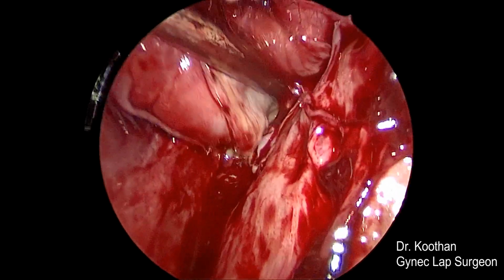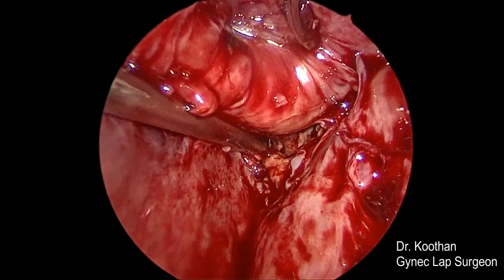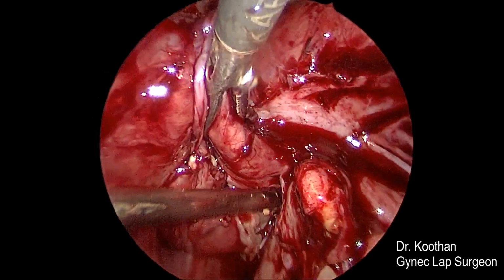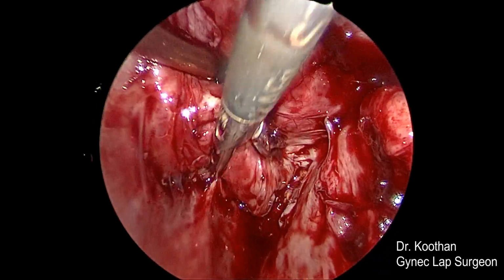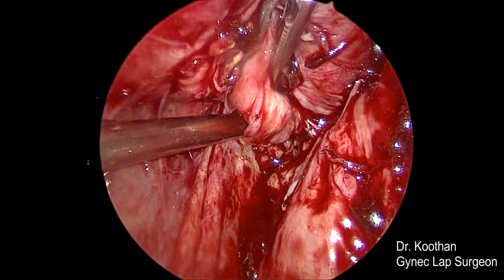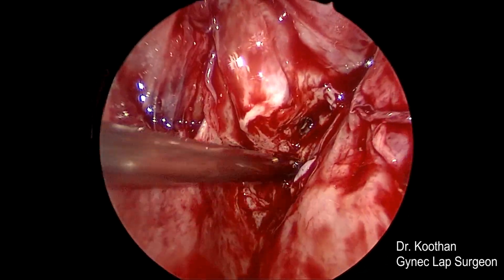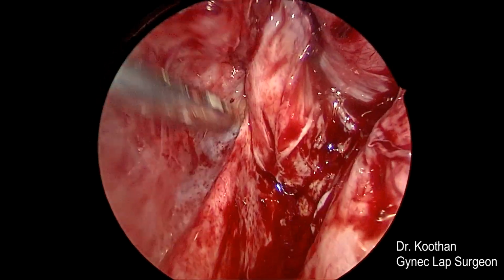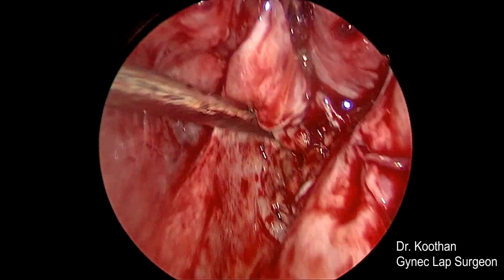Slowly we are releasing the Pyosalpinx from the peritoneal attachments. What you can see on the right side is actually the mesorectum. Laparoscopy is all about traction and counter traction in the correct plane.